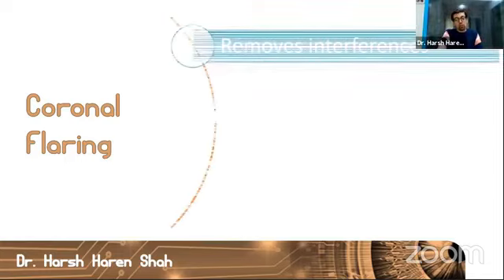In this maxillary central incisor, when I'm preparing the coronal third of the root canal, I'm not trying to enter into the middle third or into the apical third. I've located my canal. I'm going to widen the coronal third so that my subsequent instruments can be inserted very easily. Now let's see why coronal flaring is so important.